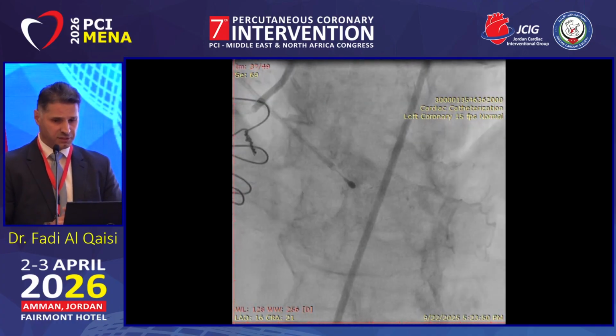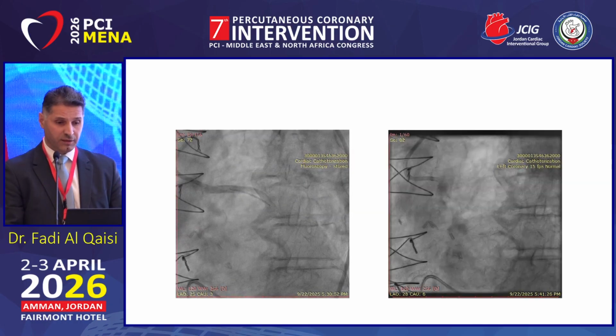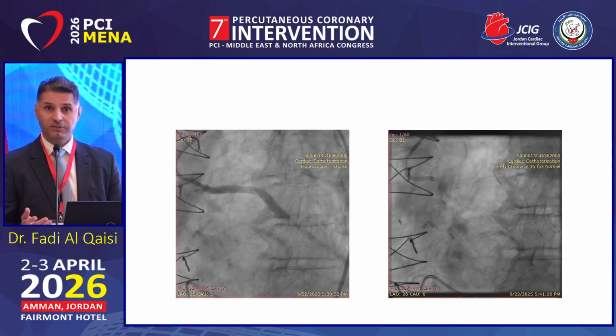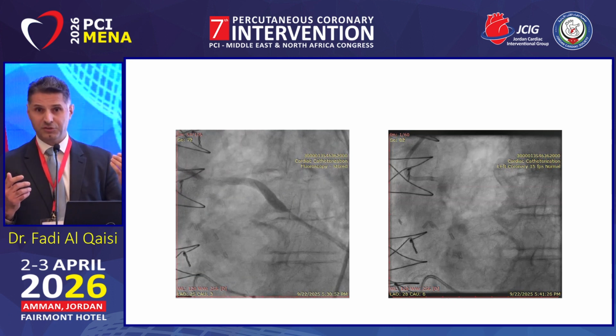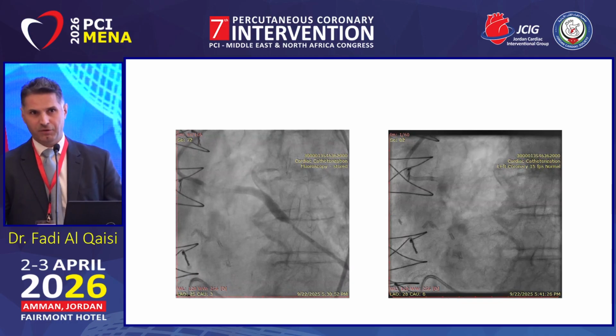And this is the final result with 2 overlapping stents. The case went very smooth. And I said to the patient, do you feel comfortable? She said, yeah. I said, okay, let's do the 3rd one as well. So we moved on to the SVG, which is the easiest step, obviously, here.